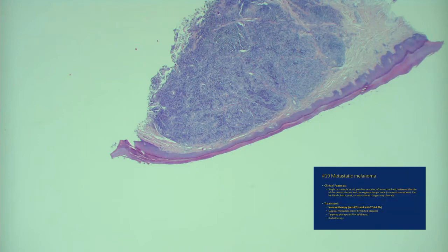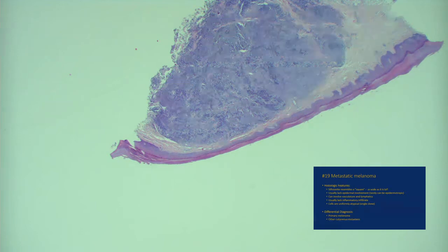So, again, you've got these features here. But that's probably from a histologic perspective, that top point is the most important. The fact that they look almost as wide as they are tall. That's helpful when you're looking at a metastatic lesion involving the skin, almost any kind of metastatic lesion, but especially metastatic melanoma. So it's really helpful when you see that. Sometimes melanoma can be pretty poorly differentiated when it metastasizes to the skin. Sometimes it stains on.